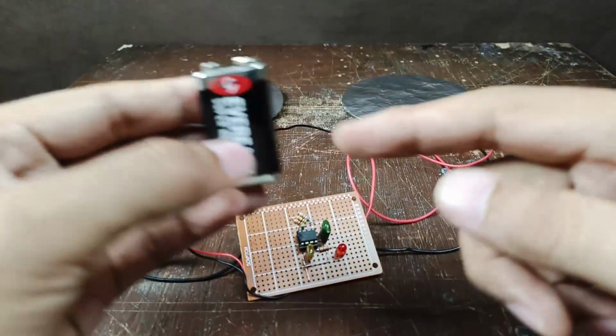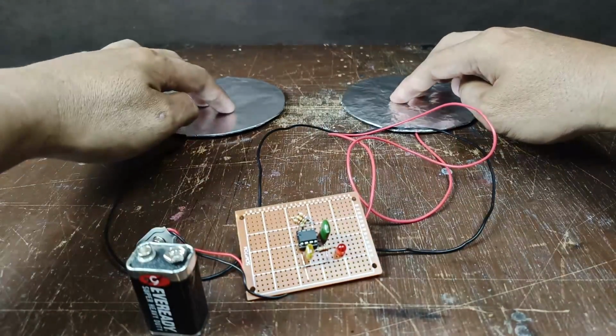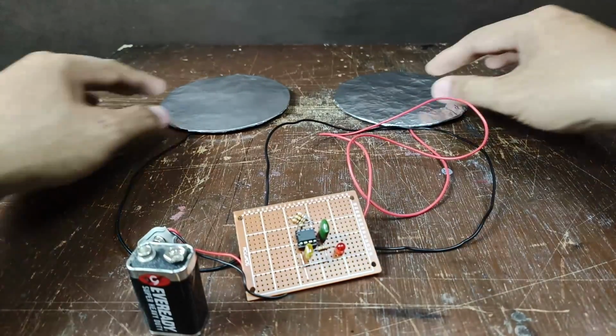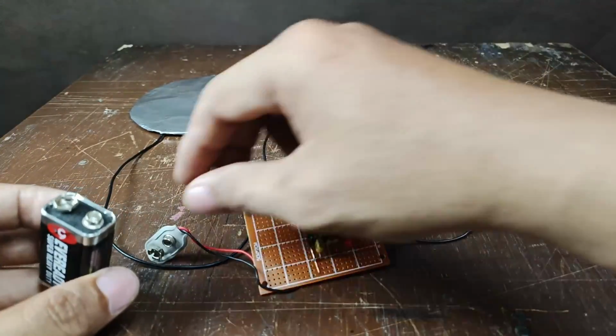Now before I connect this battery, since in my project I did not place a switch, but you can place a switch if you want. Make sure that these two pads don't touch each other, especially when the unit is already turned on, because it can cause damage to the circuit. Make sure they are far from each other. So I'm going to place the battery now and let's test this project.